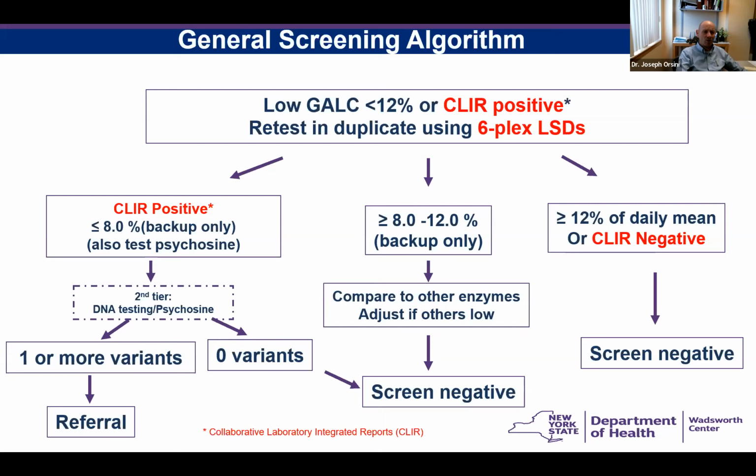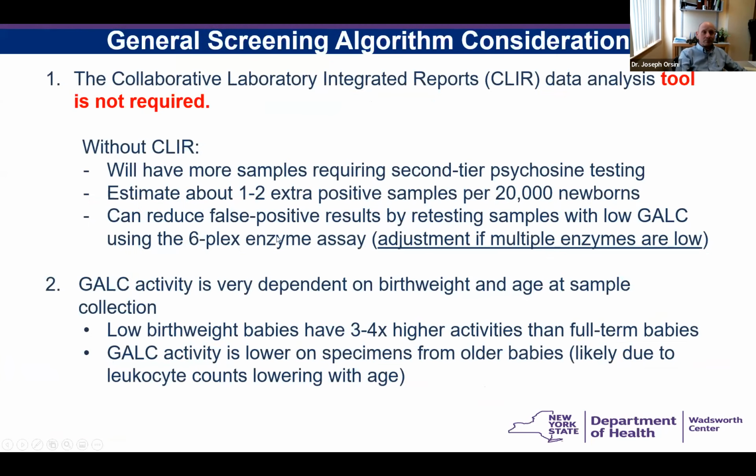So by tomorrow, we'll have GALC variant analysis. Mayo will have a psychosine sample in their hands and initiate psychosine screening. And by Saturday, we'll have psychosine analysis. Depending on the outcome of our variant testing, we'll have a better idea of just how much of an emergency this sample is. So I'm letting Dieter know via this talk that he's got a sample coming. All the rest of this is really just details, but that's what's going on now.